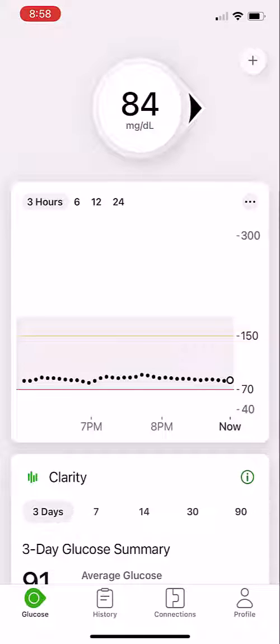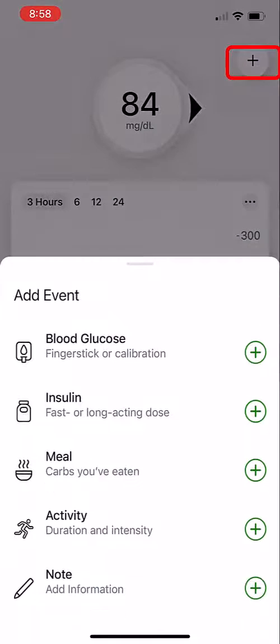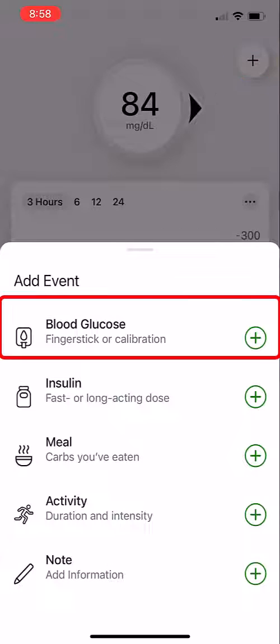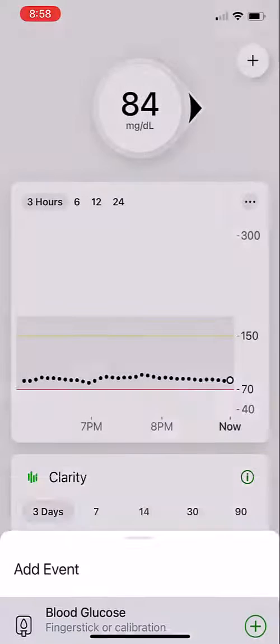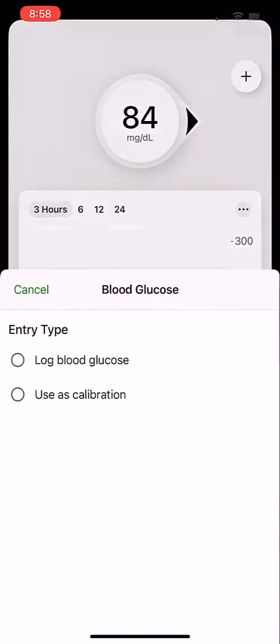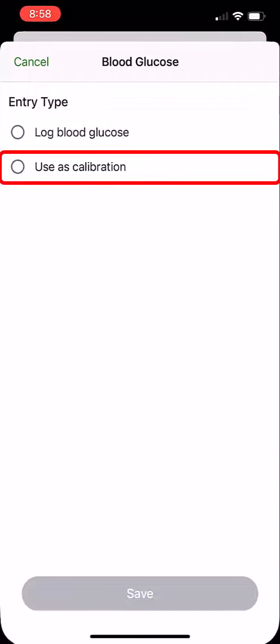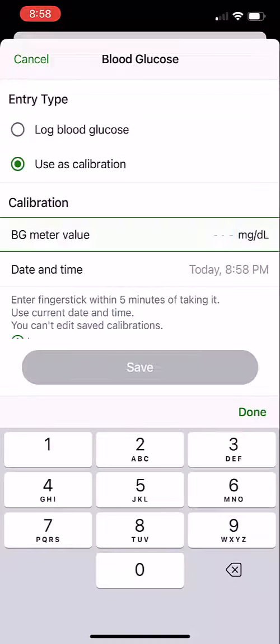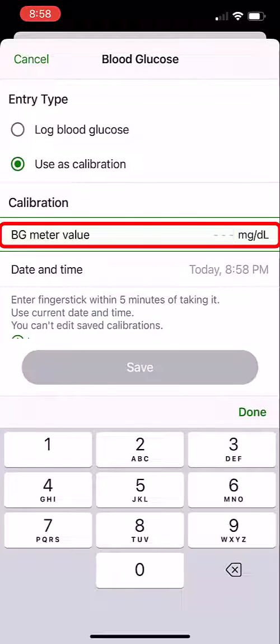The first thing you want to do is go up to the top right and click on the plus sign. It will open up this pop-up menu and click on the blood glucose. Choose 'Use as Calibration' and put in your blood glucose meter value.